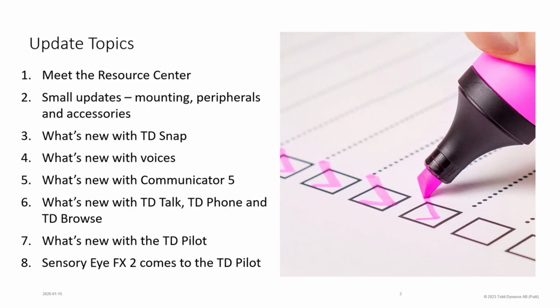We're going to start by meeting the new Resource Centre. This is your one-stop shop for invaluable free resources from Tobii Dynavox. Then we're going to cover some smaller updates such as changes to mountings, peripherals and accessories, and then we'll get into the main section starting with what's new with TD Snap.